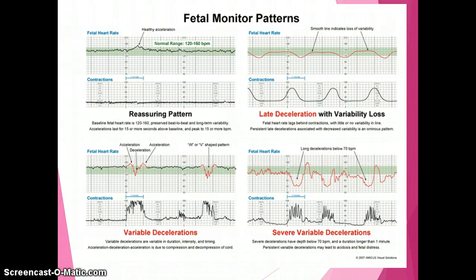With severe variable decelerations, you still have variability but very deep, very long decelerations — the variable nadir may be around 70, followed by a huge shoulder before dropping back down. That large shoulder represents the baby's recovery time. Think of a deceleration as decreased — or potentially no — oxygenation to that baby, like holding your breath. When you hold your breath for a long time, you suddenly take a deep breath; that's what the high shoulder represents. Persistent variable decelerations may lead to acidosis and fetal distress.